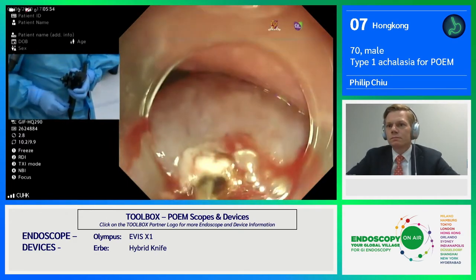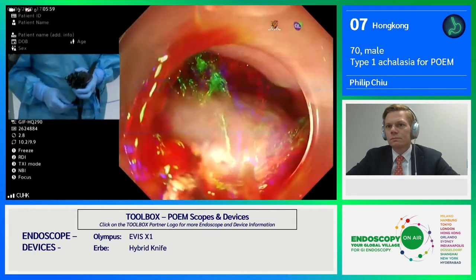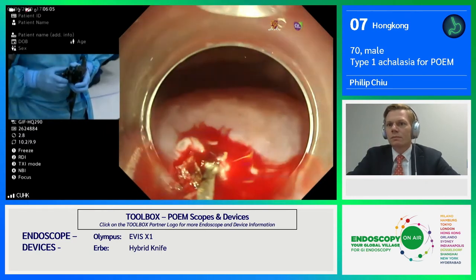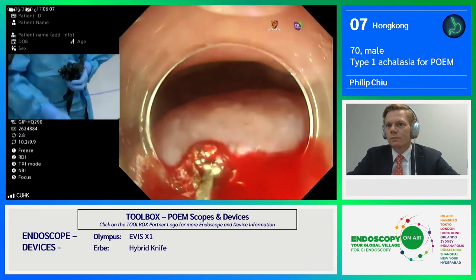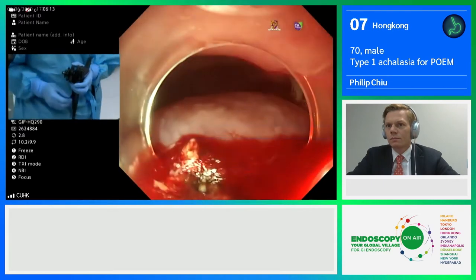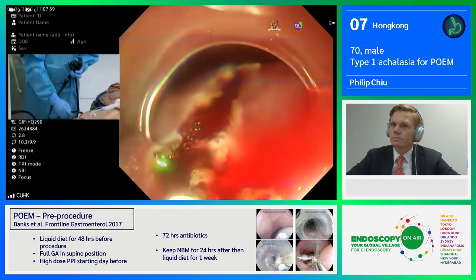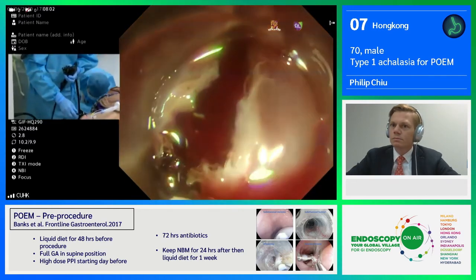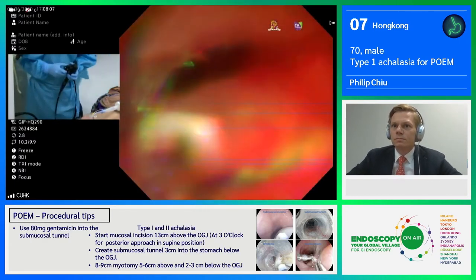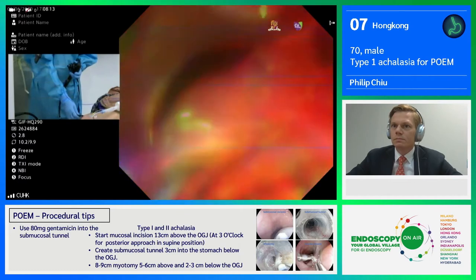We are now using the EndoCut I mode, and the effect is 1-3-3. This is more typical for the TT knife that I use. If I'm using the hybrid knife, I usually change to 3-2-4, along with spray coagulation. Now I develop the mucosal incision. In general, I would extend the mucosal incision a little bit more so that I can have a better circumference to enter into the submucosa.